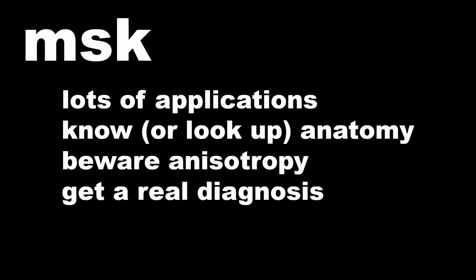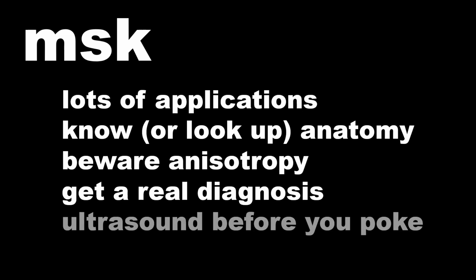Ultrasound helps you to get a real diagnosis, and I actually think it's better than MRI because you can compare it to the unaffected side. And again, before you do any sort of procedure, especially an arthrocentesis, you should ultrasound it before you stick a needle into it.